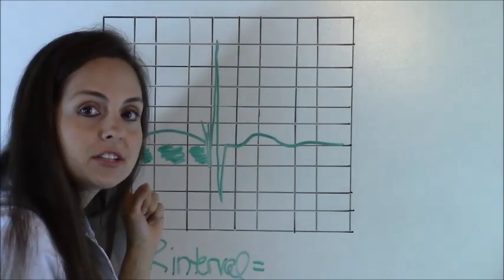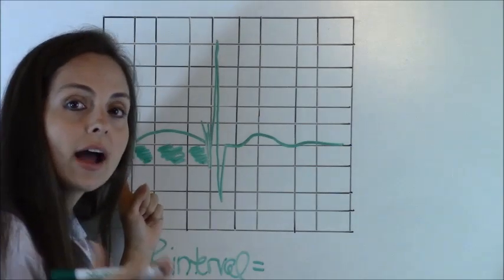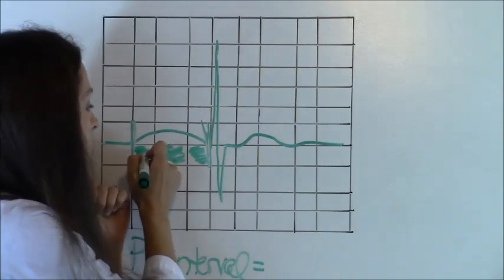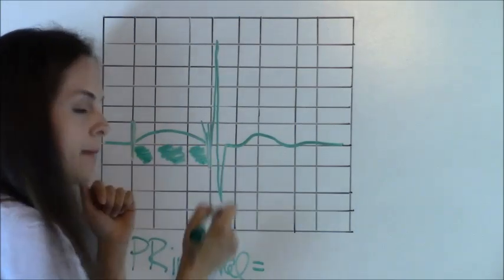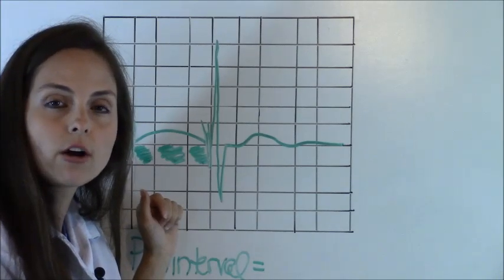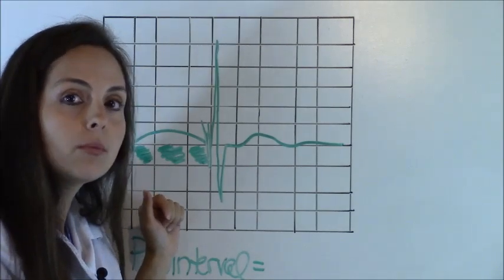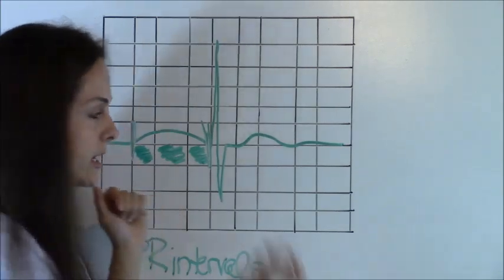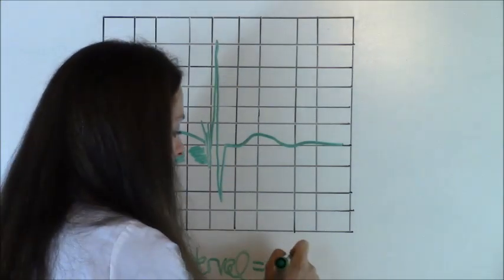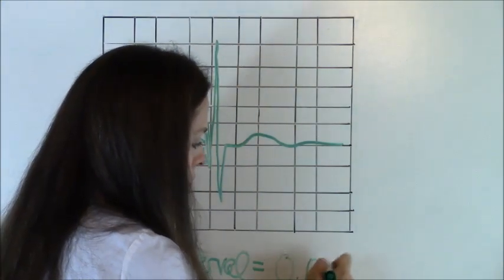Now, all we have to do is count. And we're going to count how many boxes are in between those two measurement points. And we have one, two, three. Remember each box represents 0.04 seconds. So 0.04 times three, because there's three boxes, equals a PR interval of 0.12 seconds.